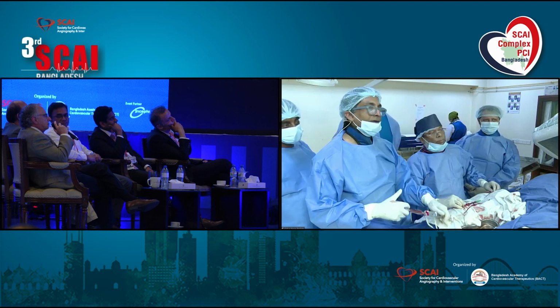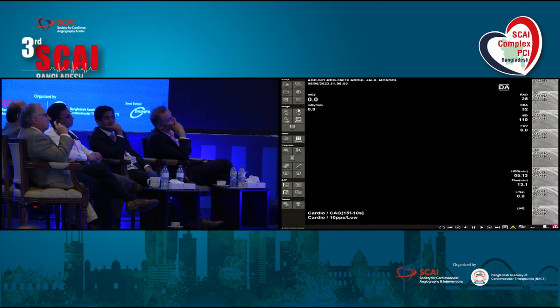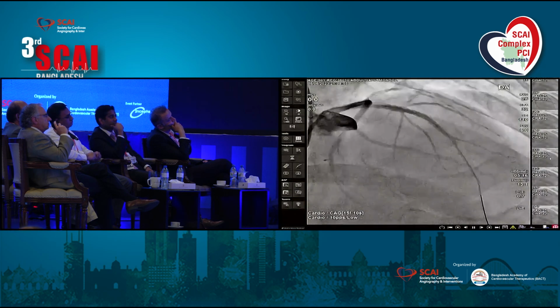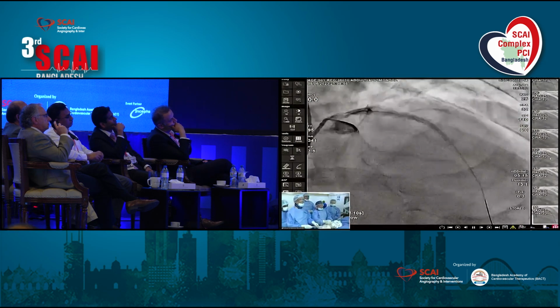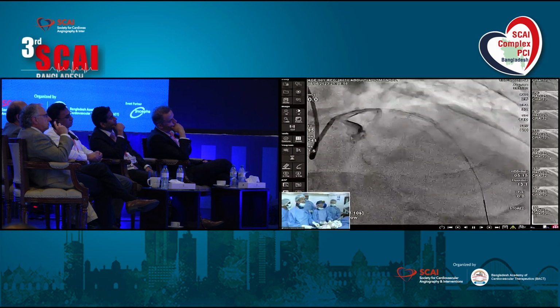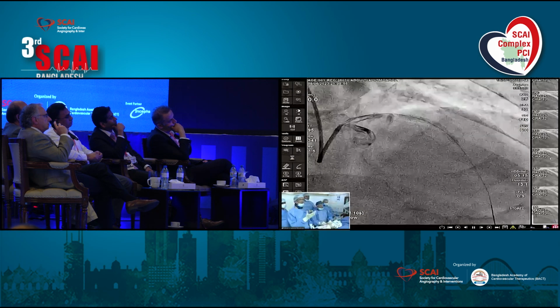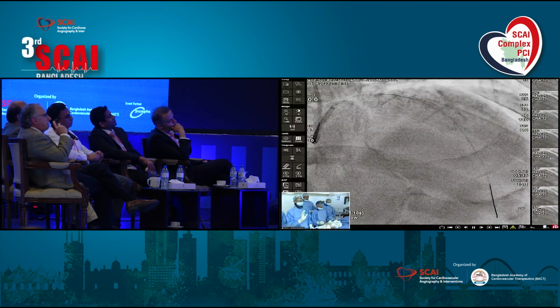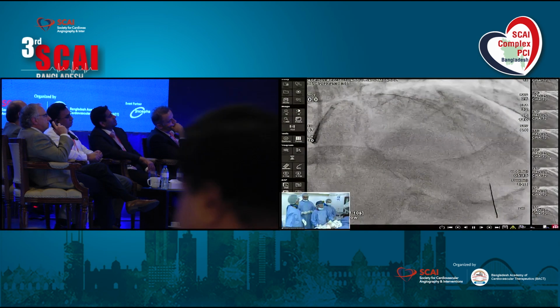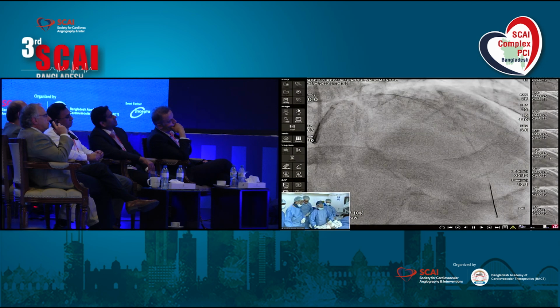And there was a jailed area that was very short, a few millimeters only. Even then, whether you have noticed or not, the side branch wire was almost stuck. Looks good. The guide was pulling back, and for the younger colleagues, I am pulling back the guide in the left hand and pulling back the wire by the right hand. So that is important to prevent over engagement and dissection by the guide catheter.